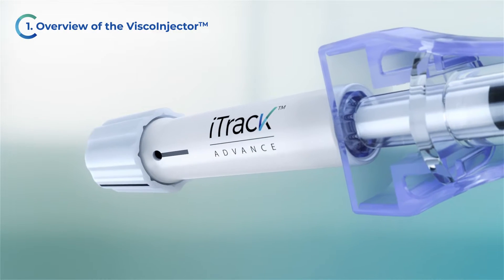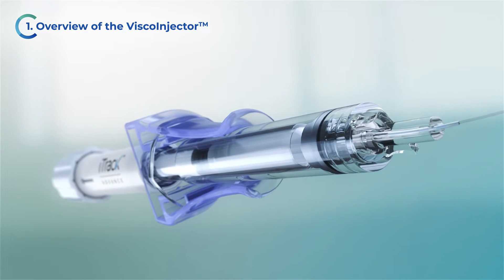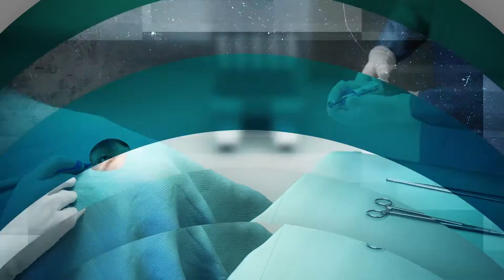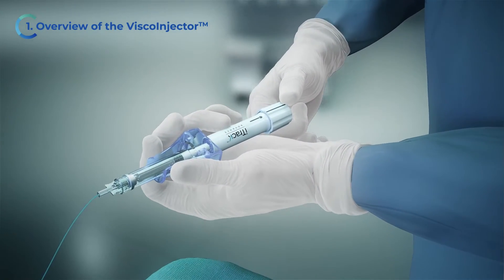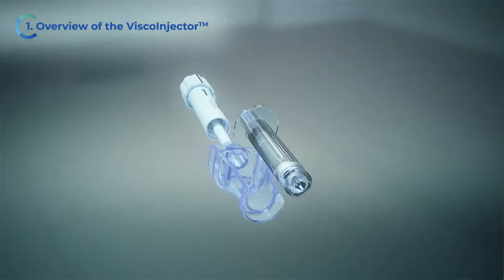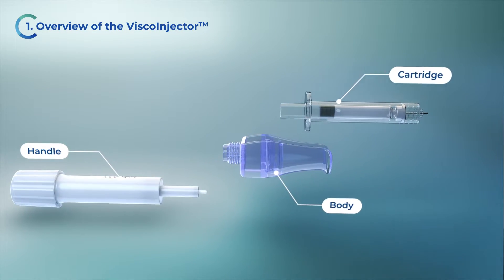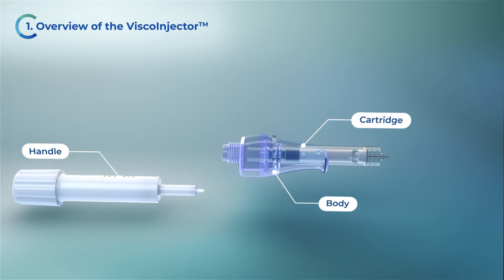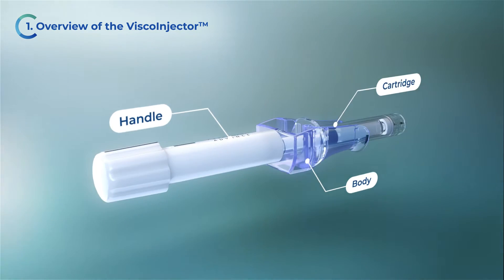The VSCO injector is a manually operated device for precision delivery of small amounts of viscoelastic fluid. The scrub nurse or technician is responsible for operating the VSCO injector from the sterile field. A cartridge of viscoelastic is placed into the body of the viscoinjector, which then connects to the handle of the viscoinjector.